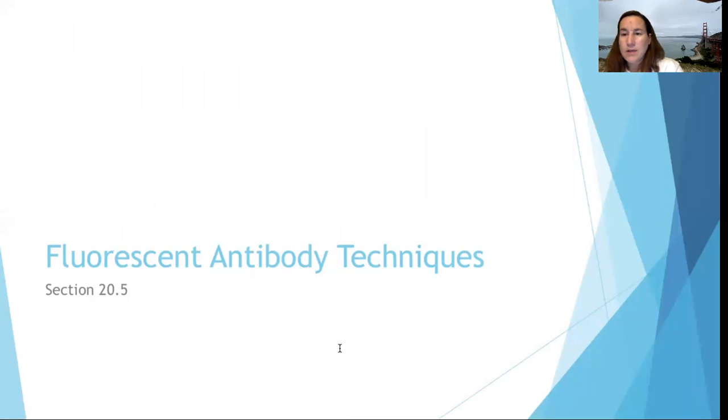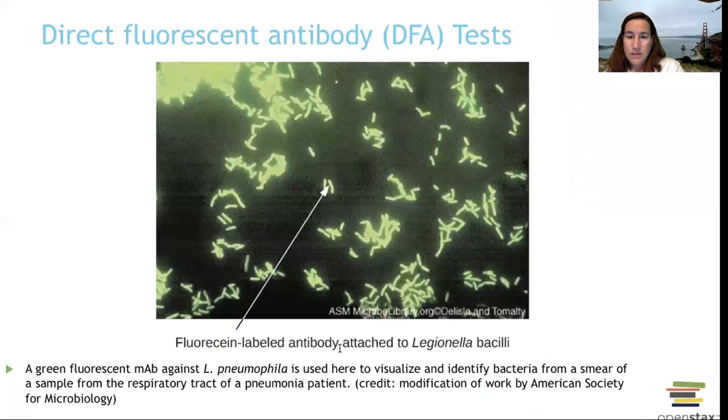Fluorescent antibody. Before those, with our lateral flows, they were going to color change. You were either going to see a red one, or you might see a blue one show up, depending on if it's gold or latex beads. With the fluorescence, it's going to fluoresce. It is going to glow a brighter wavelength light that you can pick up with equipment with our fluorescent antibodies.